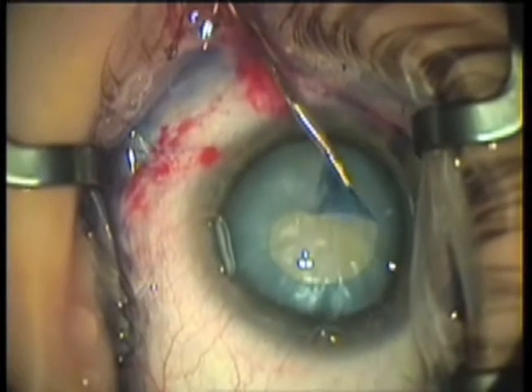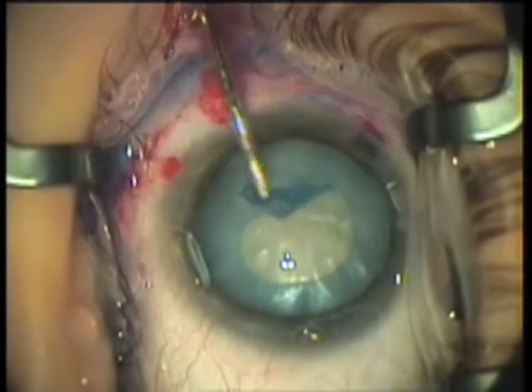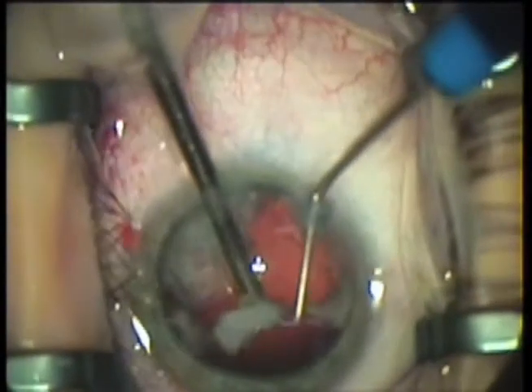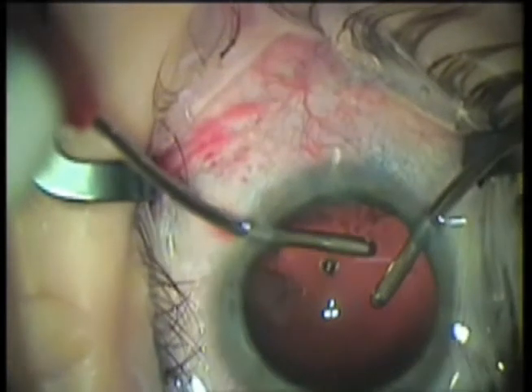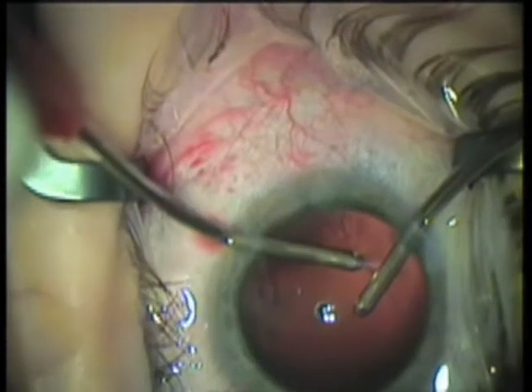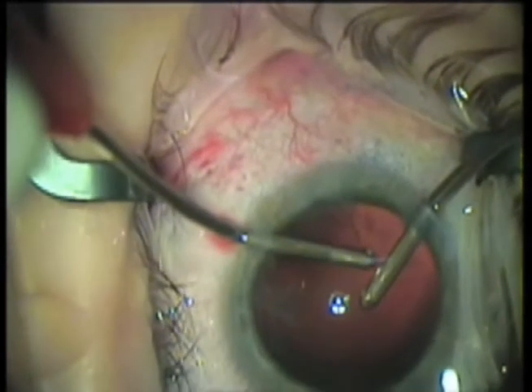Most capsular tears occur during the last stages of nuclear emulsification. The capsular bag is more prone to collapse at this stage because the majority of the nuclear material is gone and the bag is no longer held open, and the surgeon is less concentrated. Lower the bottle height, lower the flow rate, and lower the vacuum level to achieve a slow motion effect. And keep cool.